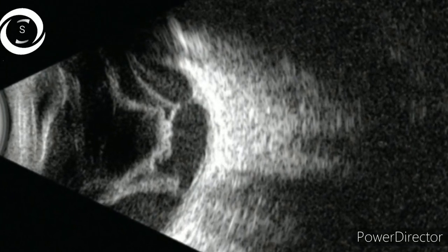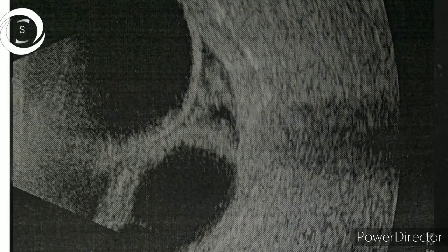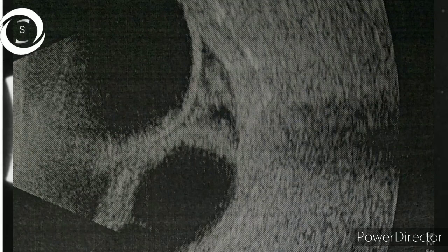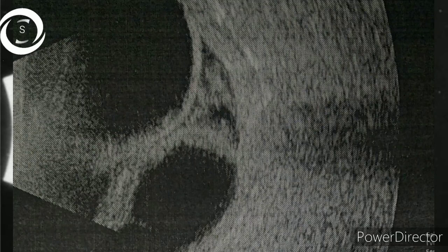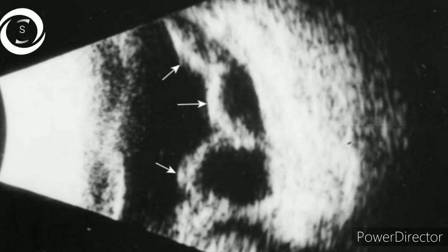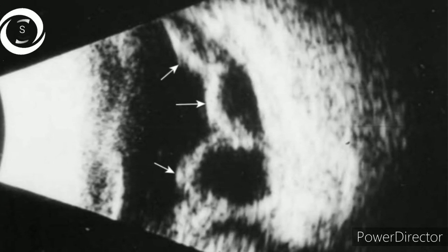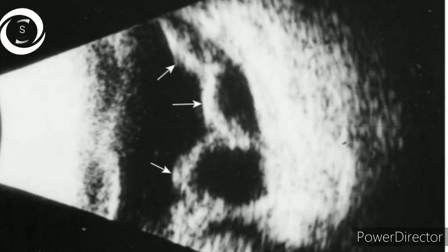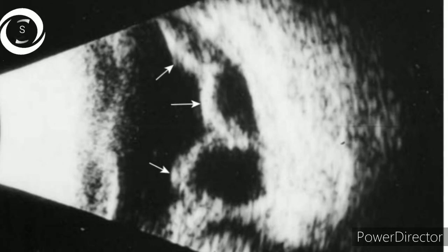In the thirteenth B scan, you can see large dome-shaped convex elevations from opposite fundal areas touching in the middle of the vitreous cavity — these are called kissing choroids of choroidal detachment. In the fourteenth B scan, arrows point towards multiple choroidal detachments with a relatively small globe size, indicating multiple choroidal detachment in a hypotonic eye.